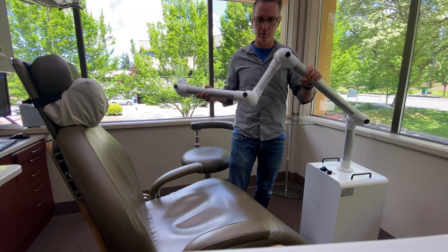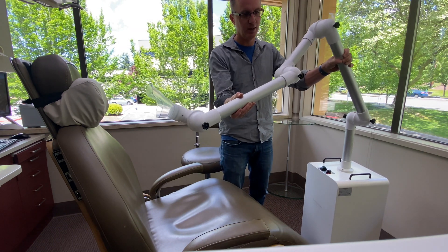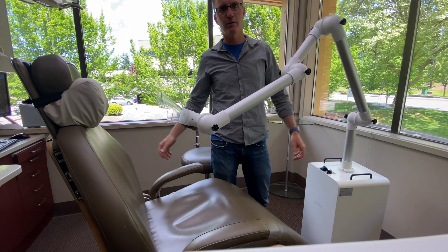You can move it around — up, down, wherever you want it. Get it positioned where you want it, tighten it up, and you're good to go.